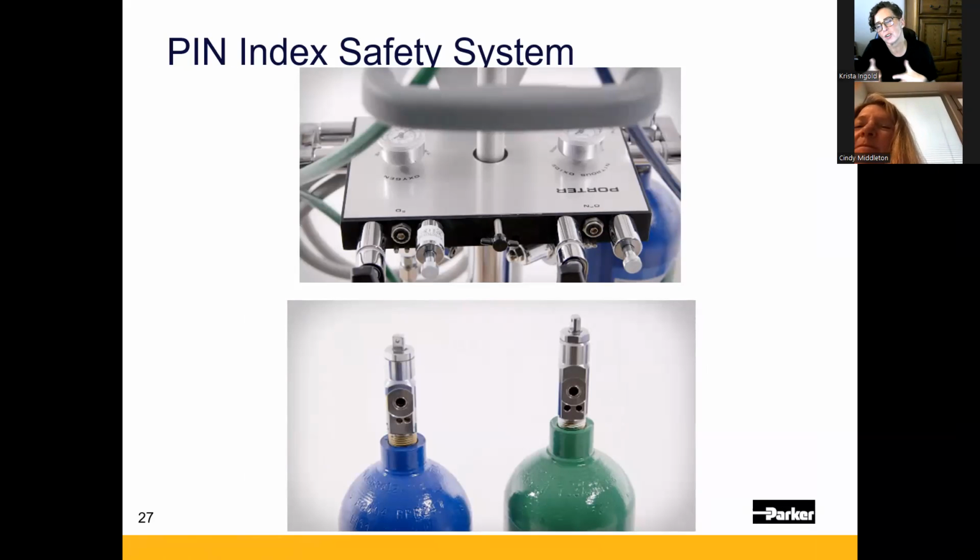And so your washer is going to end up going into the hole, and you'll see a great big ridge in your washer when you take that cylinder off, or it might potentially get all puffed up and has potential to tear the more tight you get it. Okay. I have gone to facilities pre-COVID when I could do this in person, and Biomed was the first people to put this on, and they put that so tight that they already ripped the washers.